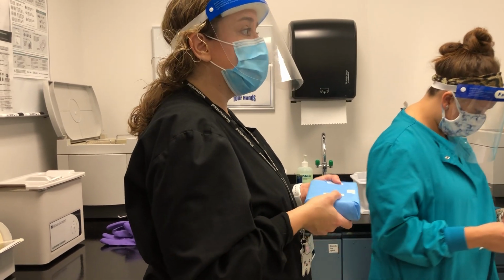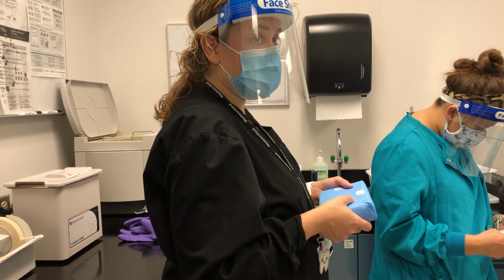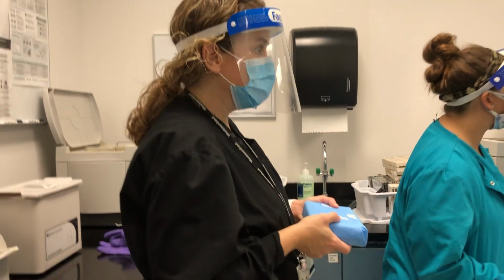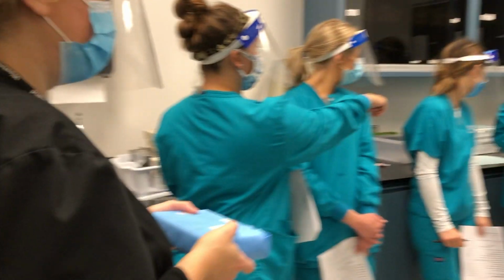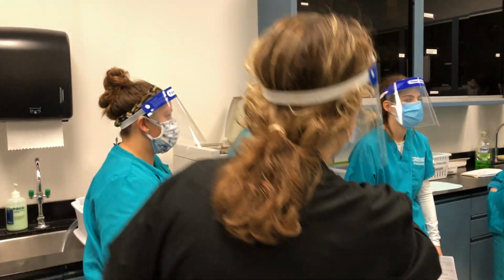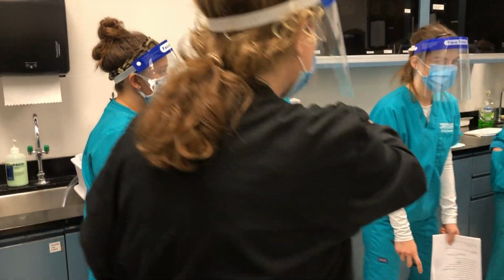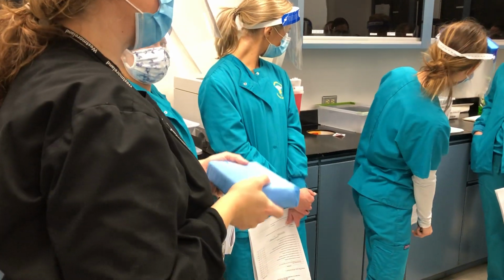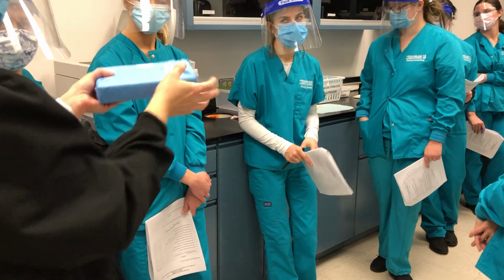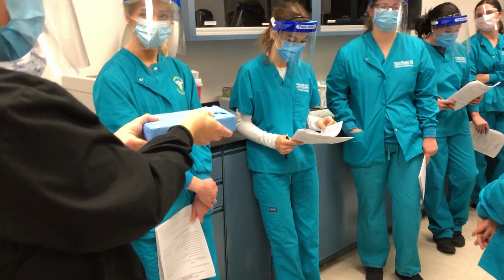Perfect. Now what if I don't have enough things to go into the autoclave? Where would I put it as a holding area? Yes. If everybody looks behind, do you mind shifting just a little to the side? There's a little bin there that says cassettes to be sterilized. If we don't have any other cassettes, we're just going to place it in that holding container, okay?